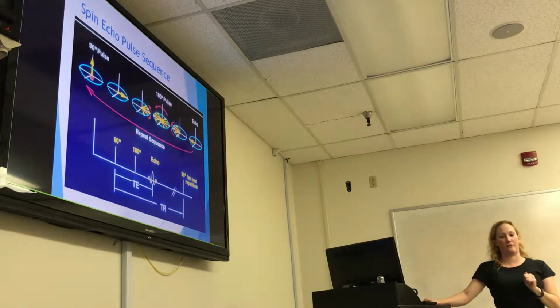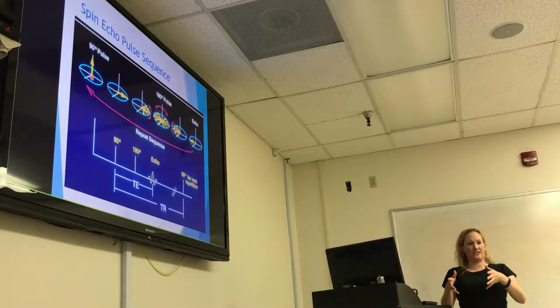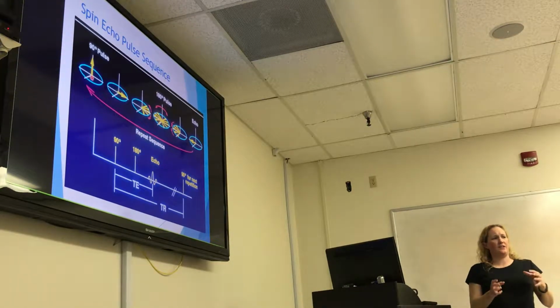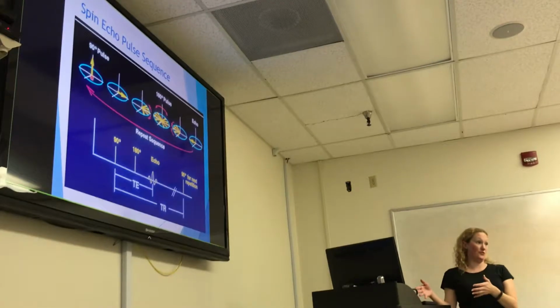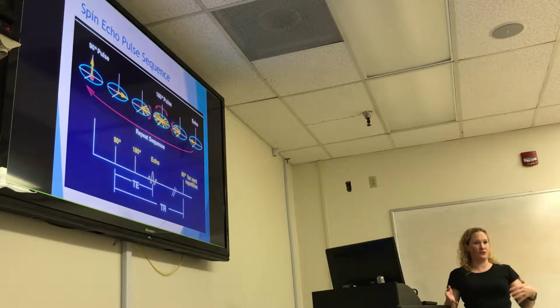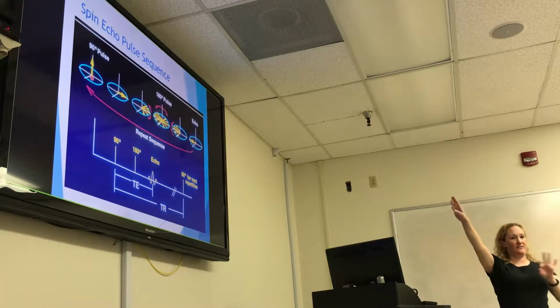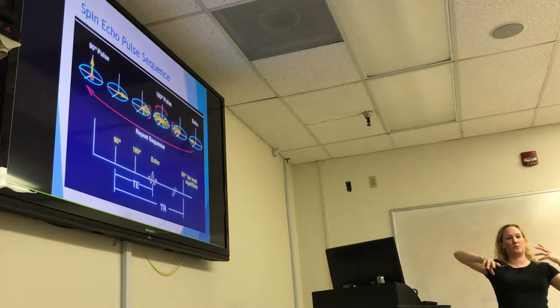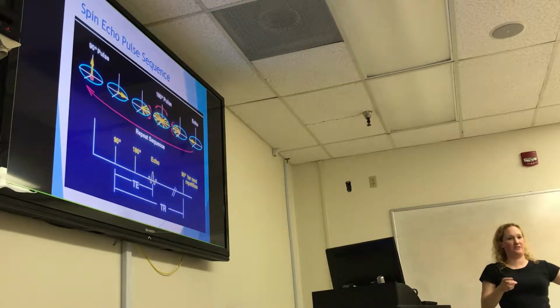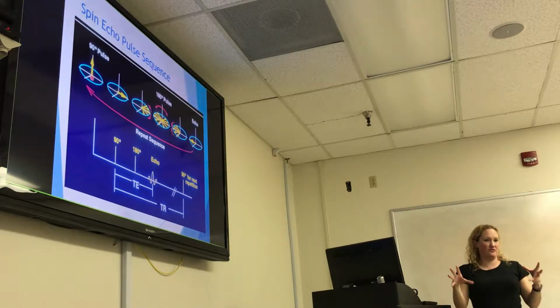There was a question, I think, from maybe 2 weeks ago that makes more sense to answer today. Somebody was asking about running a spin echo sequence and is it always a T1? You can basically get most types of weighting with any of the sequences that we'll talk about. There's always pros and cons to using a particular sequence for a particular weighting, but you can get any of those types of weighting with a spin echo sequence. You can get those types of weightings with the gradient echo. You can get them with a fast spin echo. There's all these other types of sequences, and you can get usually most types of weighting with those general sequences.